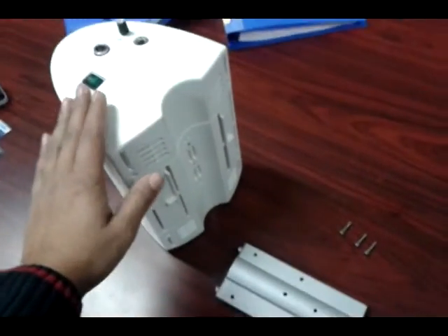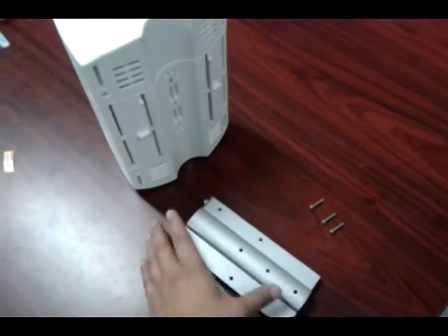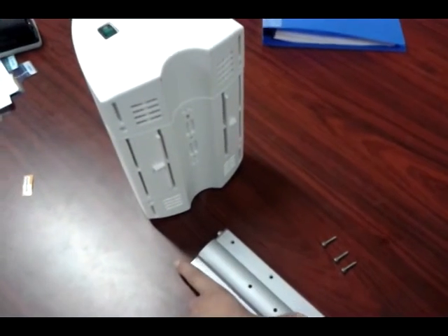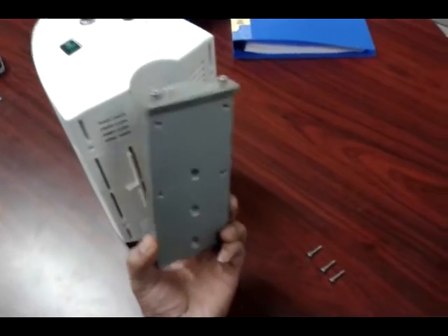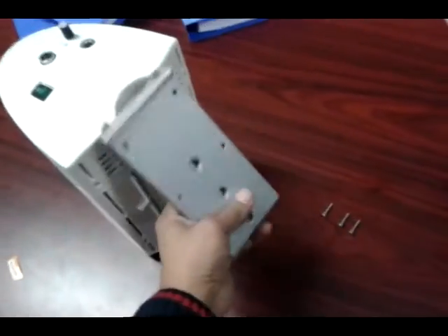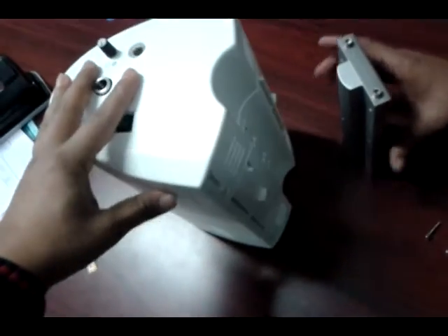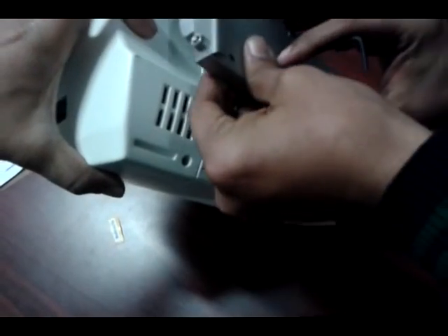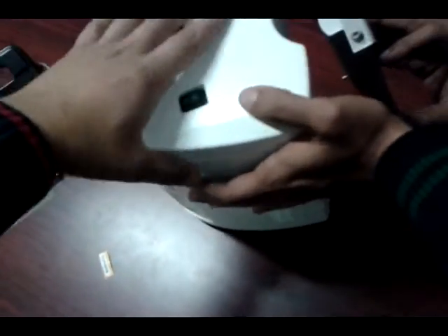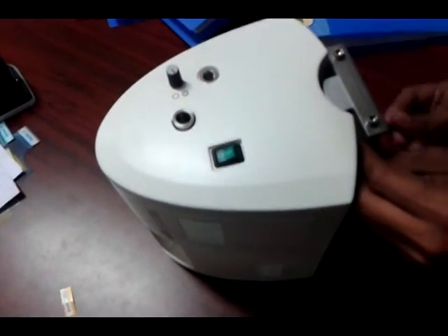This is the LED power supply with the given bracket and 3 screws, which we have to install on the Zeiss microscope. First, we have to secure this bracket like this, in this position, by securing the 3 screws.